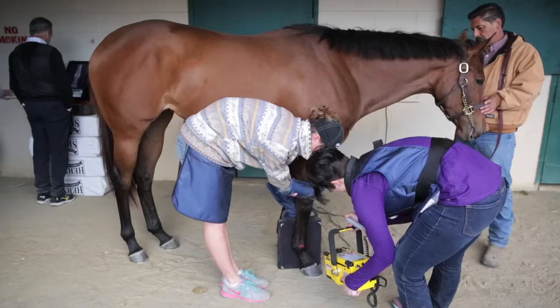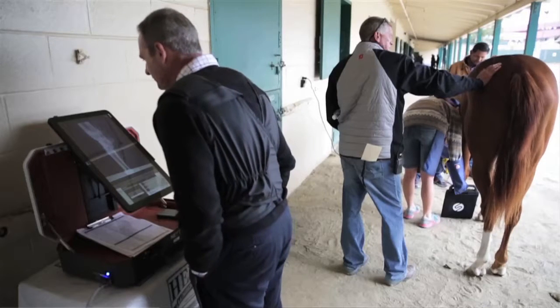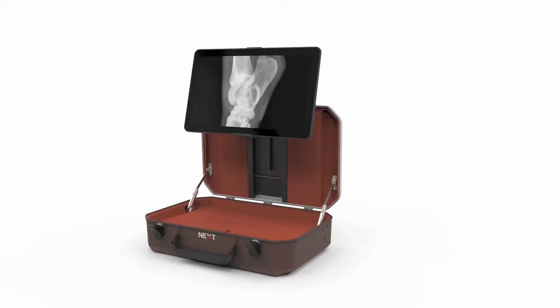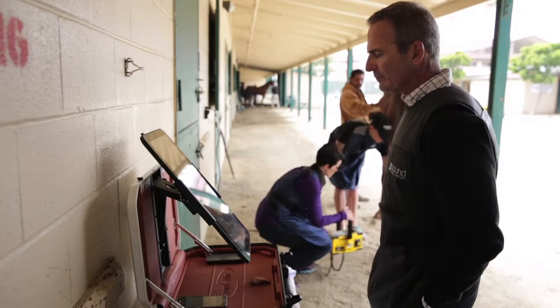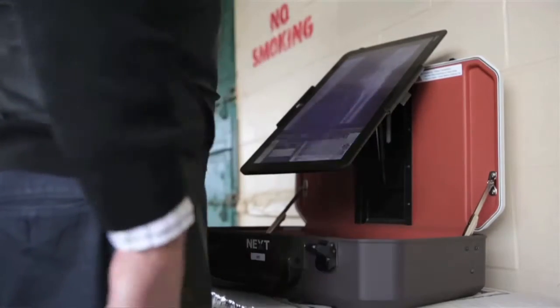I love the portability of the unit. It is very nice for me to be able to stand and use the unit. And because of the way the screen is configured and the height that I can place the unit, it's very comfortable for me. Every experience that I have with the product has been excellent as far as the usability of it.